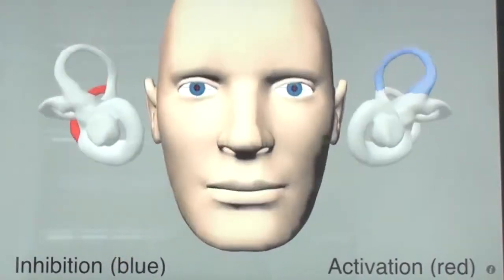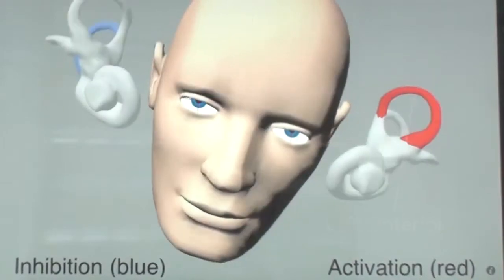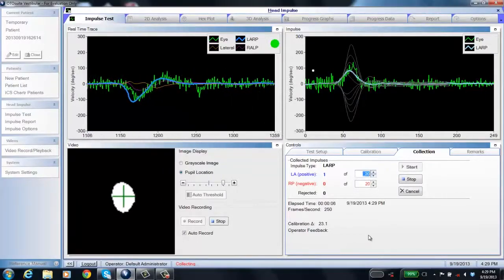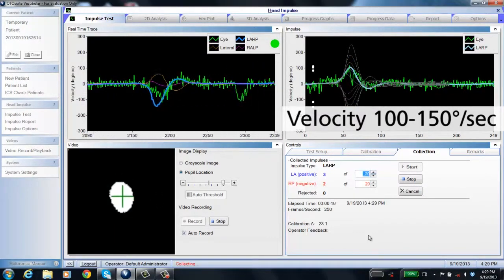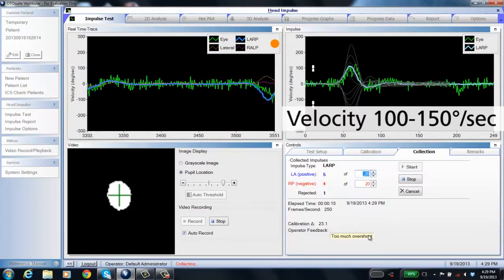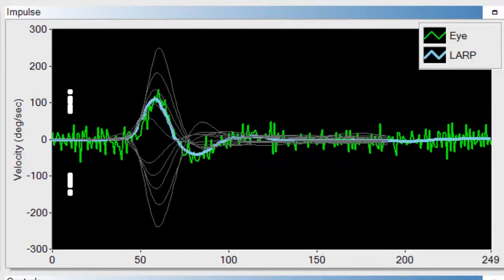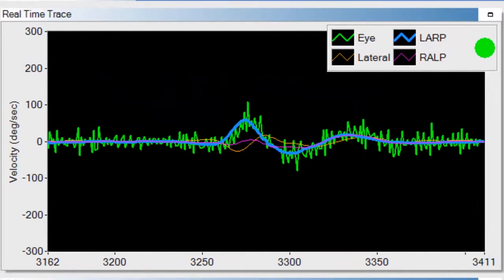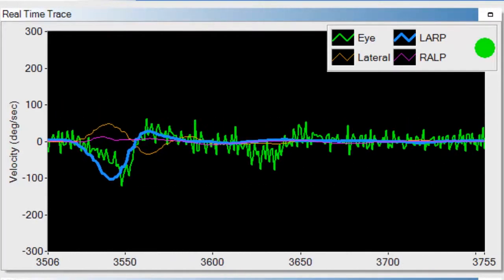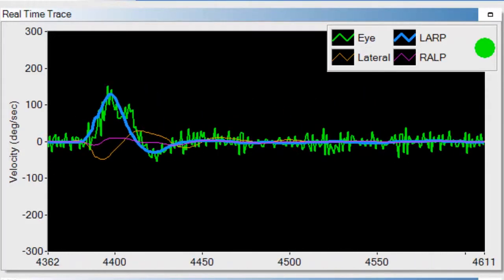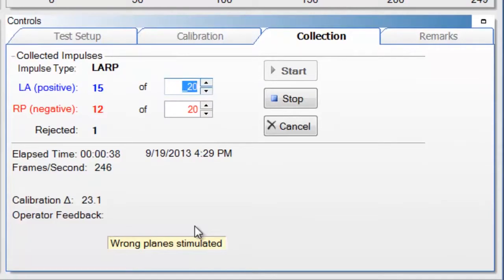When performing head impulses, moving the head downward stimulates the anterior canal, and moving the head backwards stimulates the posterior canal. It is still a small amplitude — only 10 to 15 degrees — and velocity will be slightly smaller than lateral head impulses, around 100 to 150 degrees per second instead of 150 to 200. Make sure your data matches the training curves. Only the blue head trace should be moving; the orange and pink should be fairly flat. If the head drifts toward center or the impulse is directed toward the nose, you'll get an orange light with the message 'wrong plane stimulated.'